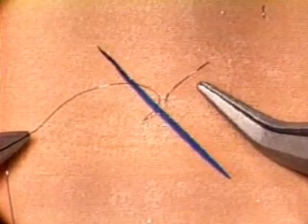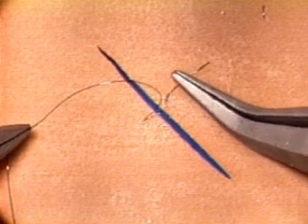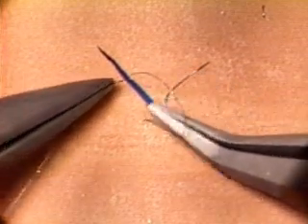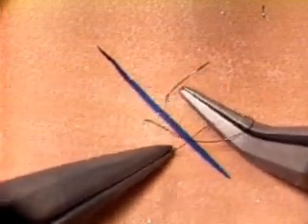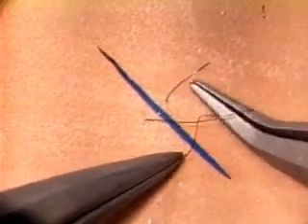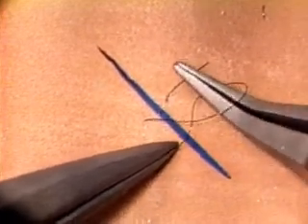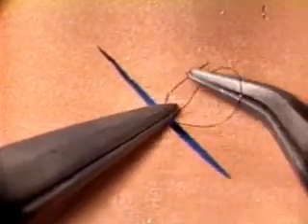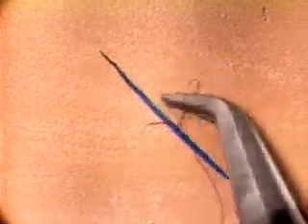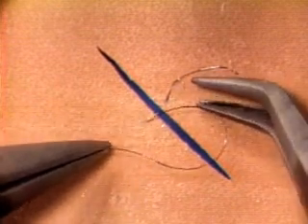Here's the struggle I get into when I fail to anticipate that problem. My thread is lying in such a direction that I won't be able to pick it up. Disregarding that, I go ahead and make a loop, and it's then that I find that I can't pick up the short end. I try the same move several times just to upset myself. Then I belatedly figure that I have to change the direction of my forceps, and in my efforts to make that gross movement, either I pull the short end through, or the loop falls off the forceps.